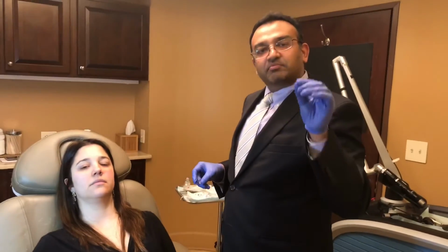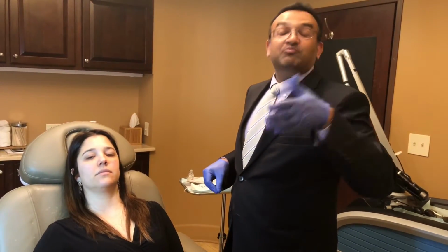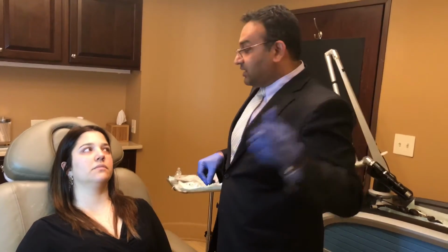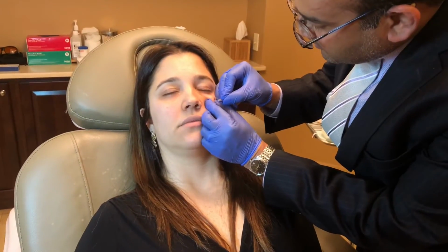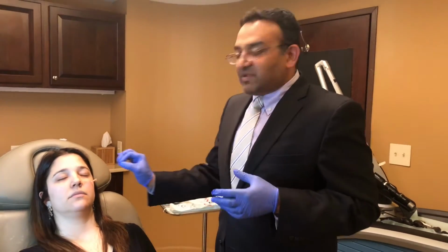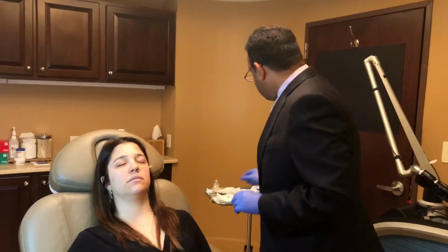So it's really just that initial pinch, and the anesthetic does burn a little bit going in, but within about 5 to 15 seconds, it actually already starts to become numb. So what we're going to do is find that area we went in, and we're going to use that. This is again our introducer needle, all we're using it for, and this is the only other poke that she's going to have, because this creates a very tiny hole, and through that again we're going to introduce the cannula through it.